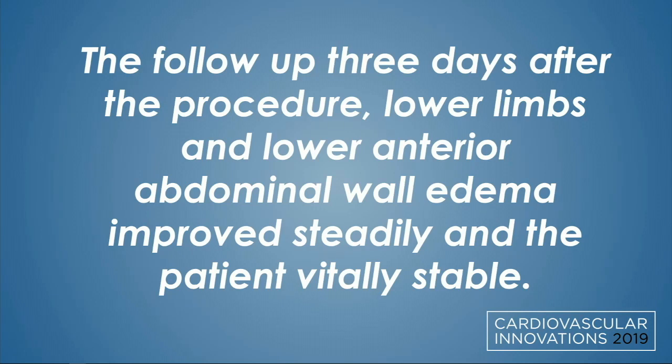Most of the IVC stenting I've done has been for iliac vein issues, in which case we tend to oversize a fair amount, mostly because of the dreaded complication of embolization of the stent up into the heart. So can you discuss why you chose to oversize this way? Because usually we oversize pretty aggressively, at least for the iliac veins.